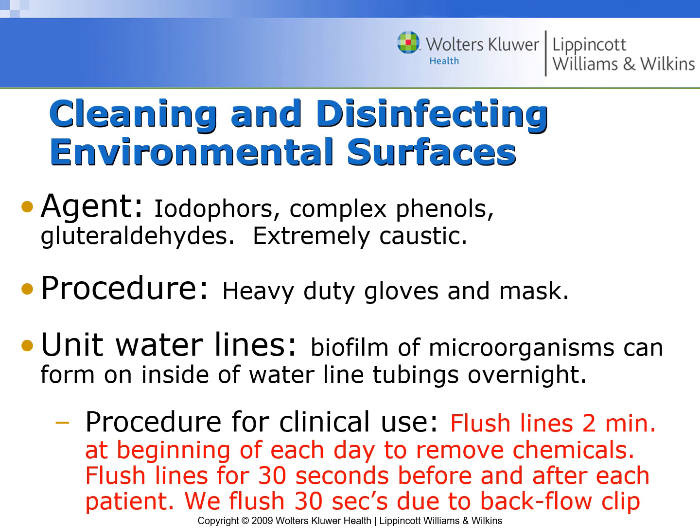So the water unit lines, biofilm of microorganisms can form on the inside of the water line tubings even just overnight. So that's why we flush the lines for 2 minutes at the beginning of each day to remove the chemicals. We're going to flush the lines for 30 seconds before and after each patient. And we flush 30 seconds due to the backflow clip. We have a backflow clip at our clinic, which prevents a problem when you put the suction in the patient's mouth and say close down and they suck on it to remove any liquid and saliva in their mouth.